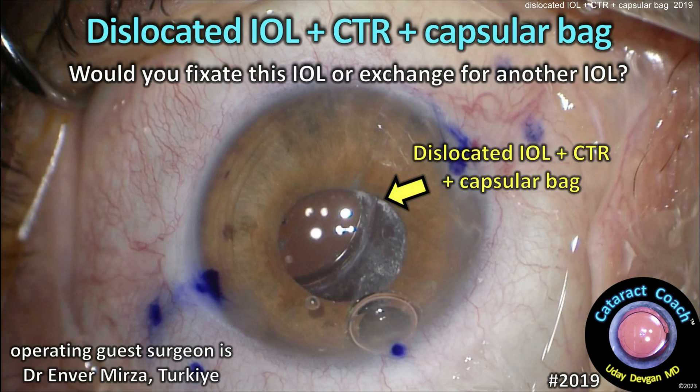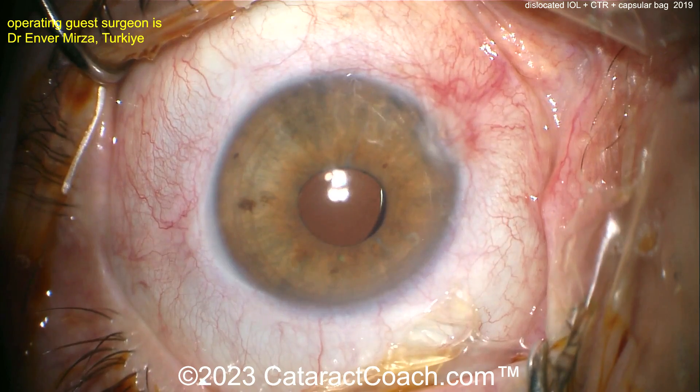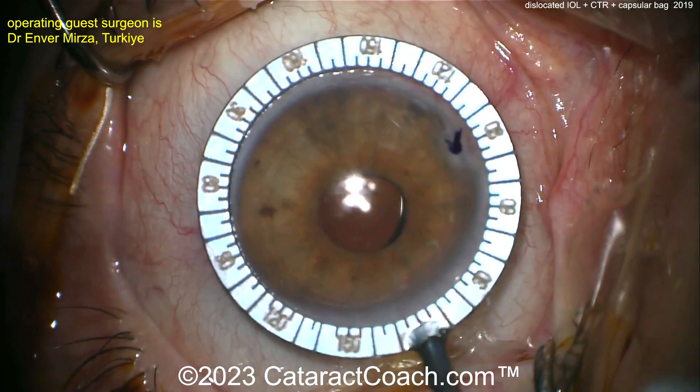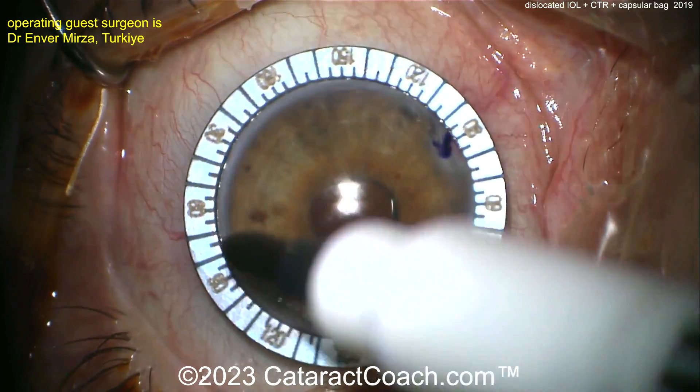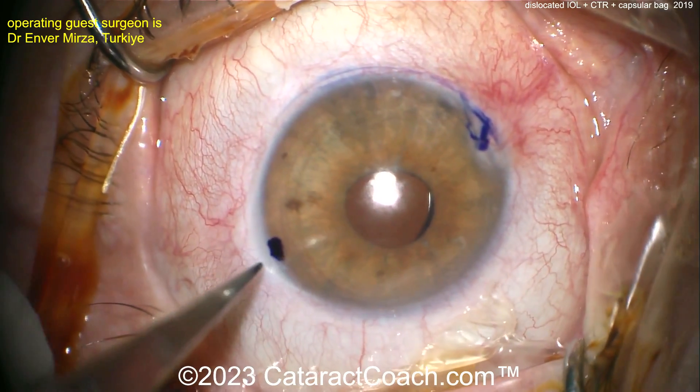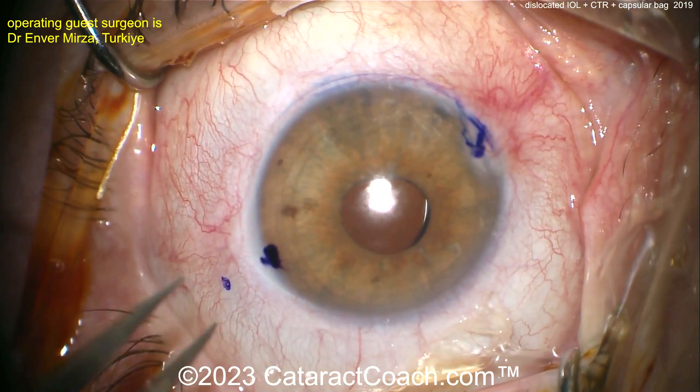From cataractcoach.com: a dislocated IOL with the tension ring and capsular bag — the whole complex is loose. How do you fixate this lens, or do you want to exchange it for a different lens? Let's take a look. Watching for the first time together — making some marks at the 180 meridian, opposite each other. You can already tell this is going to be a Yamane technique.